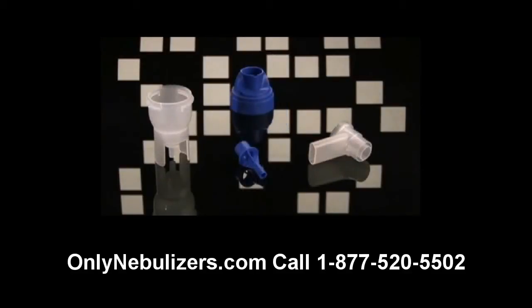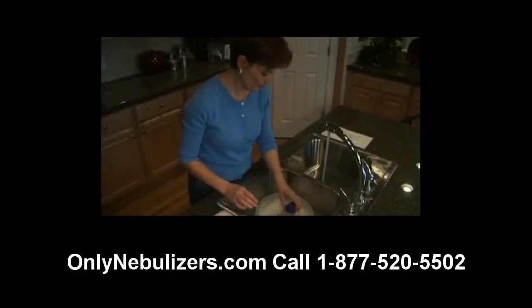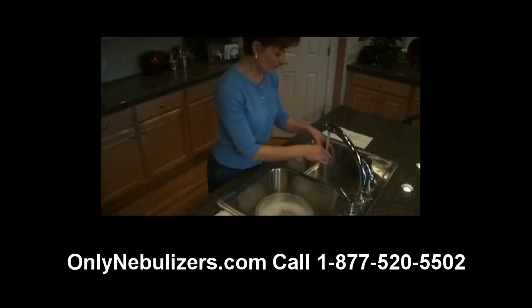The reusable nebulizer consists of a mouthpiece, cap, medication cup, baffle, and tubing. Before you use your nebulizer for the first time, clean all parts by following the instructions provided later in this video.